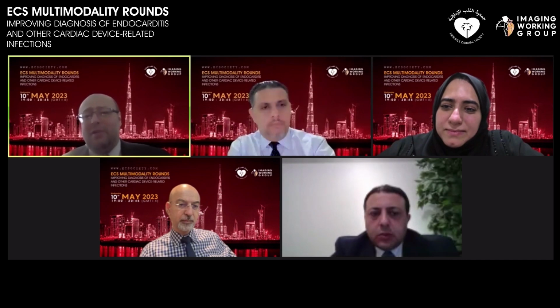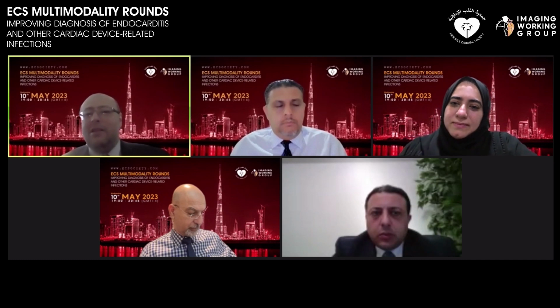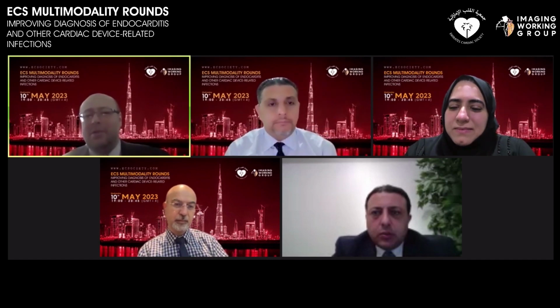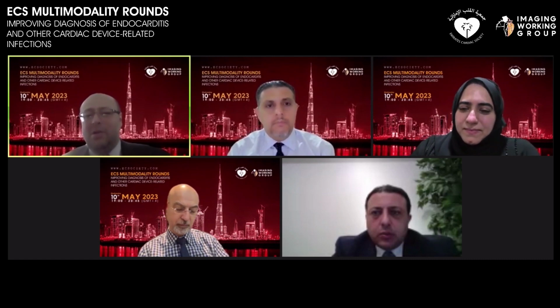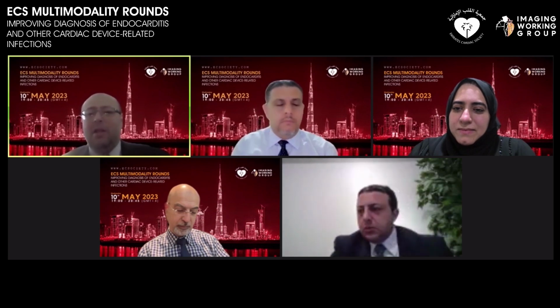Another important factor for FDG PET is if the patient has already been on antibiotic therapy. We are a referral center. We get patients who have been in another hospital for 15 days getting antibiotics, and now they're coming to us. So in these, I have to lower my threshold to call something. Most likely, if it was true endocarditis, it's not going to completely go away. But a milder uptake is not going to be as intense compared to somebody who's antibiotic naive. So the duration of antibiotic therapy is going to be very helpful. For example, recently I was taking care of a patient who had multiple TAVR infections, and he had very mild FDG uptake.